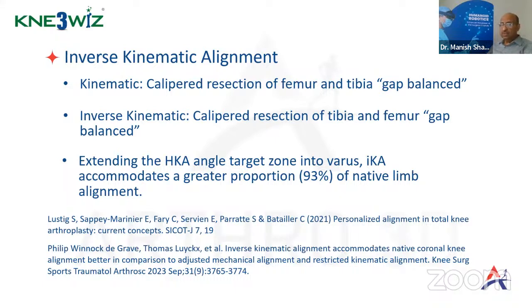If they are equal, we are restoring the native tibial alignment. Based on that, femur is gap balanced. Thus, we are able to achieve both a good balance and restore the natural tibial alignment for that individual.